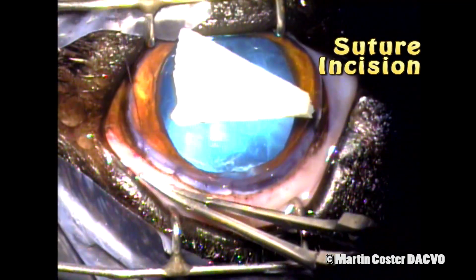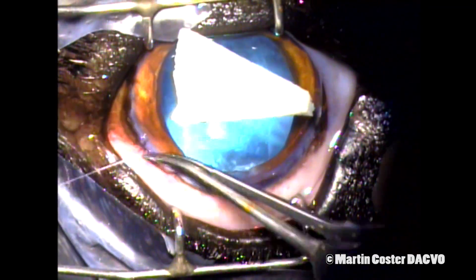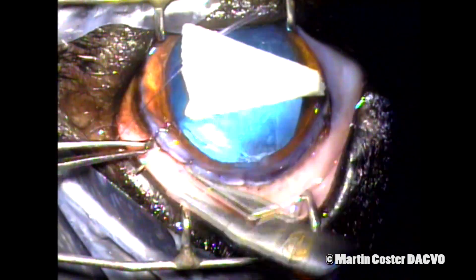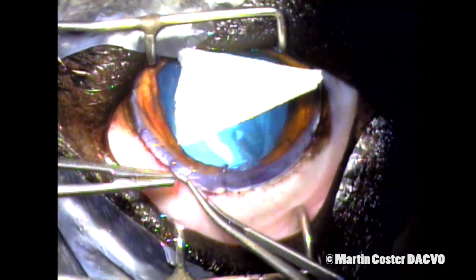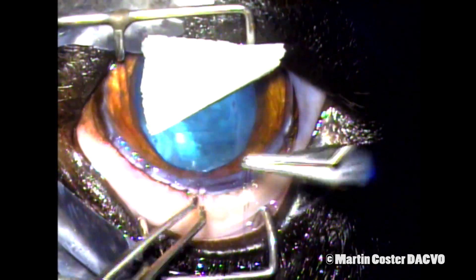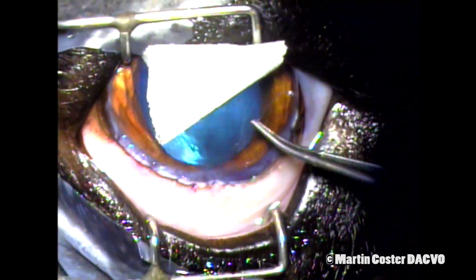We complete the corneal closure starting on the left-hand side of the image, which is the lateral aspect, and proceeding medially. I prefer to use 8-0 Vicryl for this surgery and a simple continuous pattern is all I've found to be necessary. Sutures are placed approximately every millimeter. Tightening the sutures to make sure that we don't have any leakage, and tying the first run so I can complete a second run for the more medial aspect. These sutures will dissolve, typically between three and four weeks we see the dissolution process.